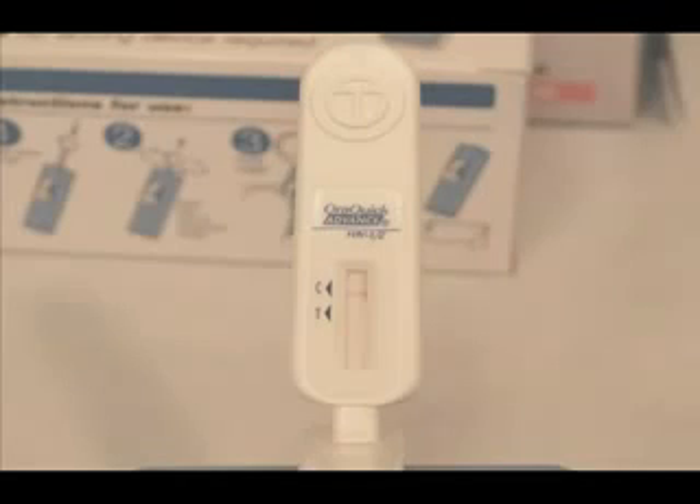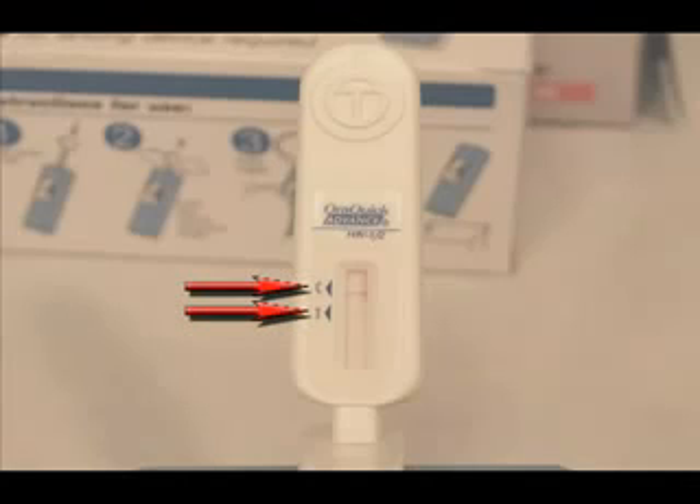The next step is to interpret the results. A test is non-reactive if a reddish-purple line appears next to the triangle labeled C, and no line appears next to the triangle labeled T. A non-reactive test result means that HIV-1 and HIV-2 antibodies were not detected in the specimen. The test result is interpreted as negative for HIV-1 and 2 antibodies.